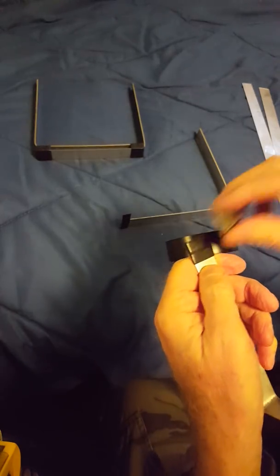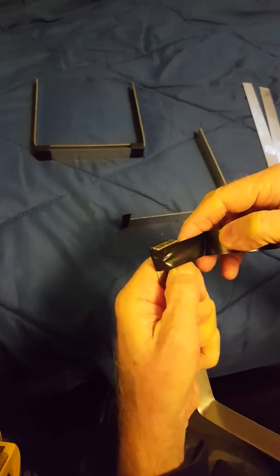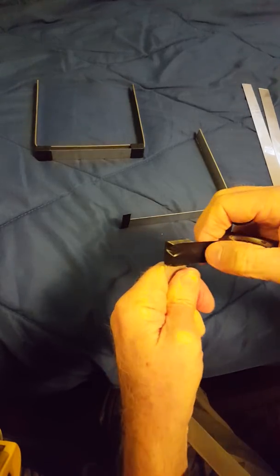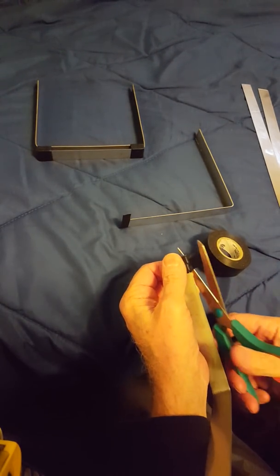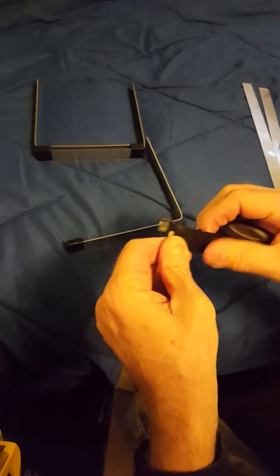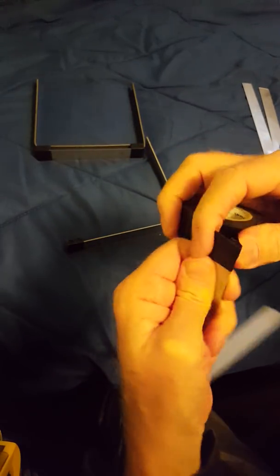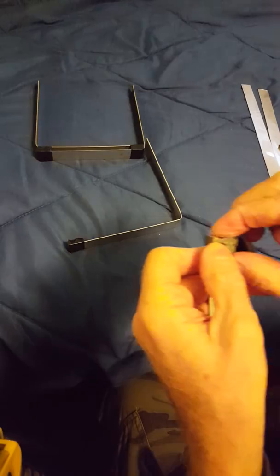And then you take your shim, stuff it in there, and give it a couple more turns there. There we go. 1 turn, 2 turns. And we're going to take our trusty scissors and we're going to snip this off right there. Now, when you look at it, the shim is on the top. When you go to do the next one, the shim will be on the bottom. So we're going to do the exact same thing. Try to keep everything on the screen here. We're going to bind this up like that. Okay, now we're going to take the shim and put it on the bottom.